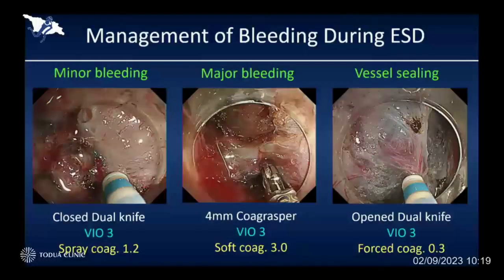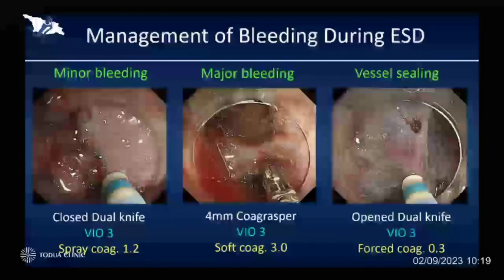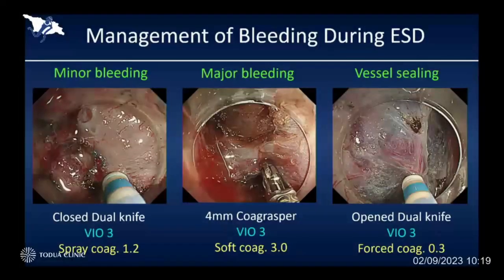For major bleeding coming from an artery, we usually use the coagrasper to stop the bleeding. Soft coagulation is very effective to stop bleeding without any severe tissue damage. And in case of finding a thick blood vessel, we can still control the vessel by using the open tip of the dual knife using a very low setting of forced coag, which is 0.3.